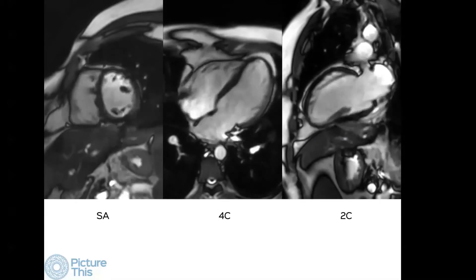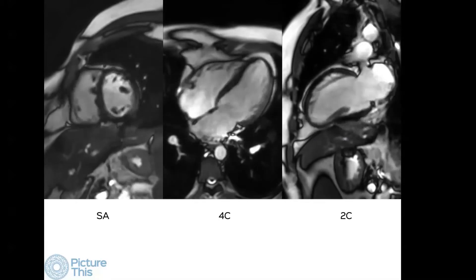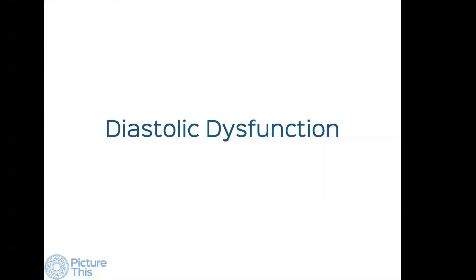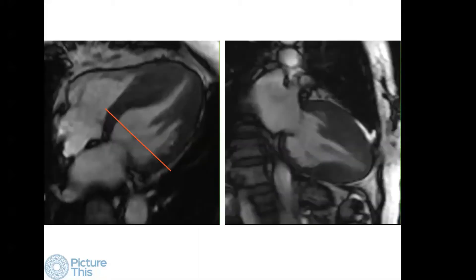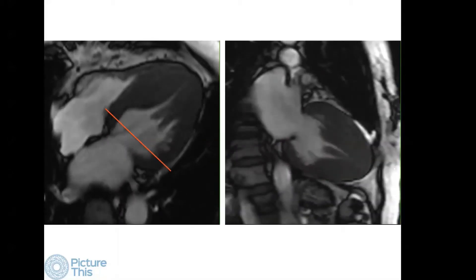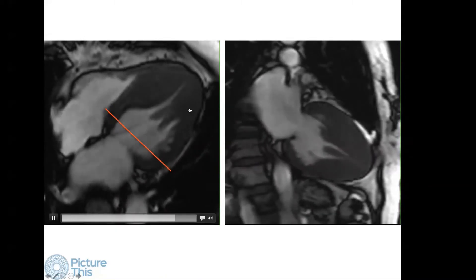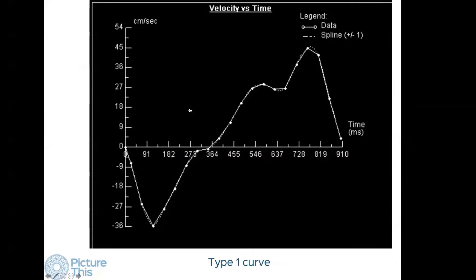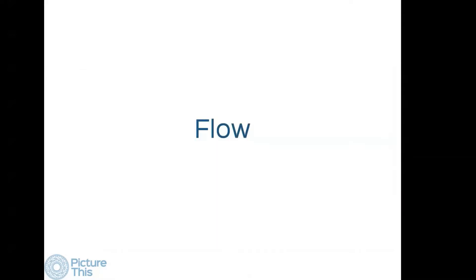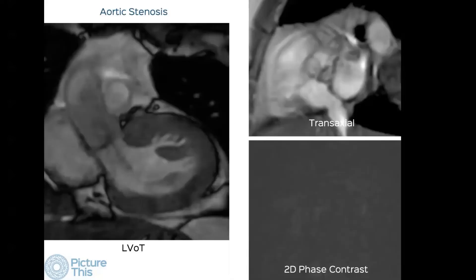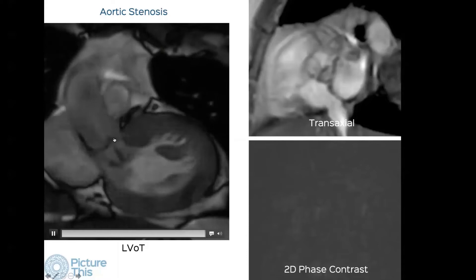We can also look at diastolic dysfunction, though we don't do this on a routine basis. We can look at transmitral flow — this is a patient with hypertrophic cardiomyopathy; we measure the LA volumes and get typical curves. The other functional analysis we can do is flow analysis. Here is a patient in the left ventricular outflow tract (LVOT) view showing both aortic stenosis and regurgitation.